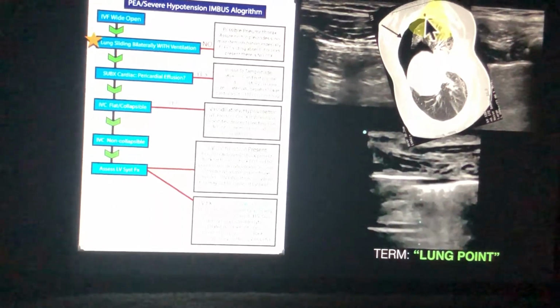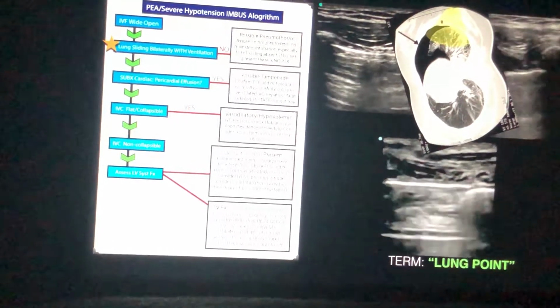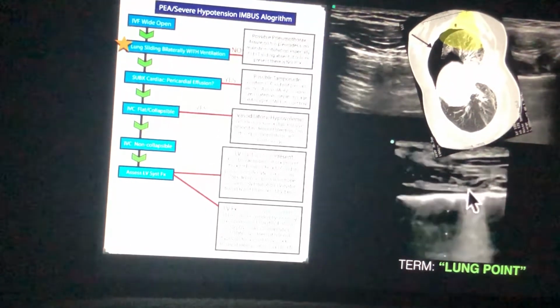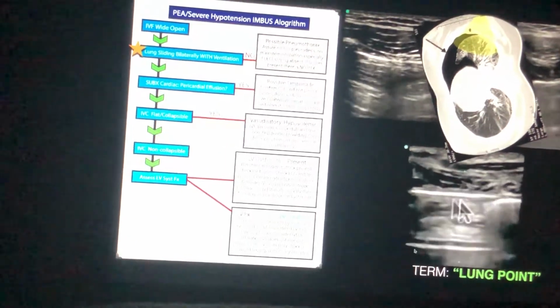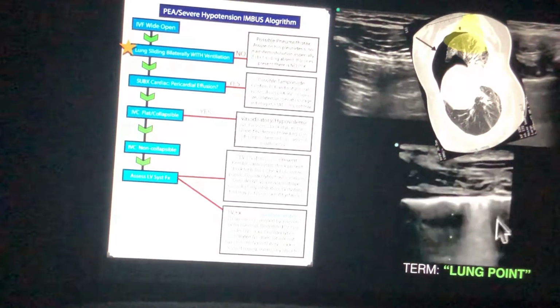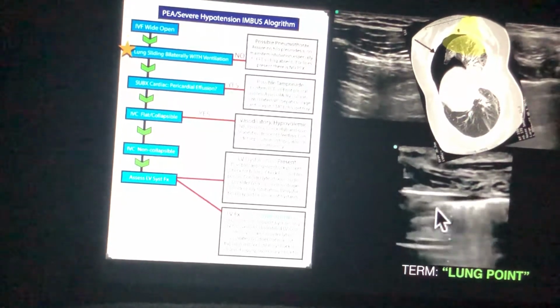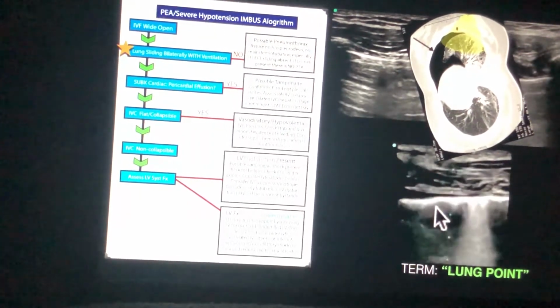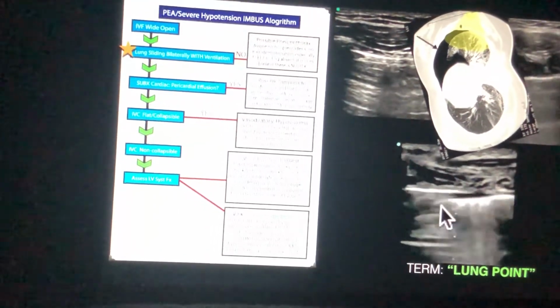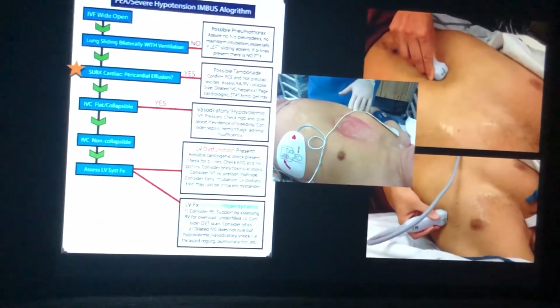And the alternation of lung sliding with pneumothorax, a really pretty reflection of what's up above, is called the lung point. And here you can see in this bottom image moving left and right on the screen as the pneumo comes in and then goes out, comes in and out here. So this is lung over here on the right side up against the chest wall, alternating with air coming in from the left side. And this is the lung point. And this is 100% pneumothorax, unless you're mistaking this for something else, but the lung point is the way to rule in a pneumothorax.